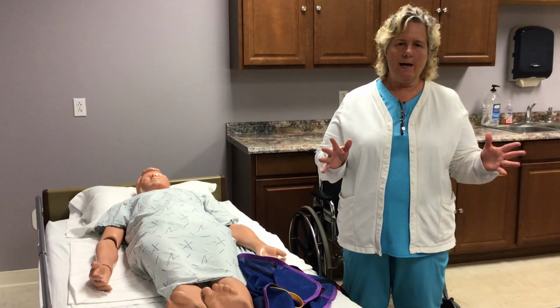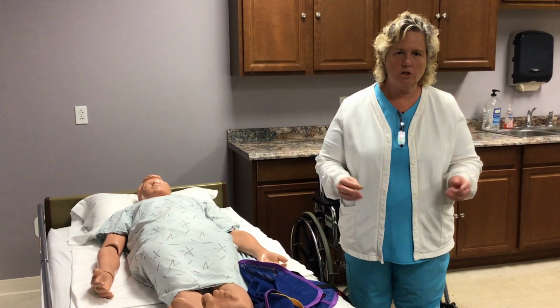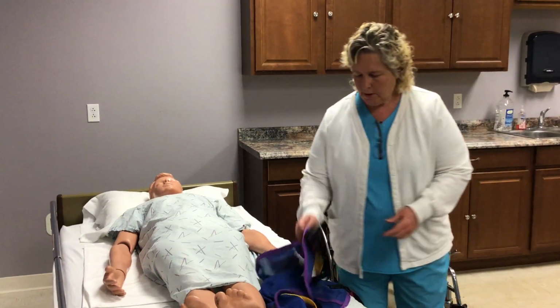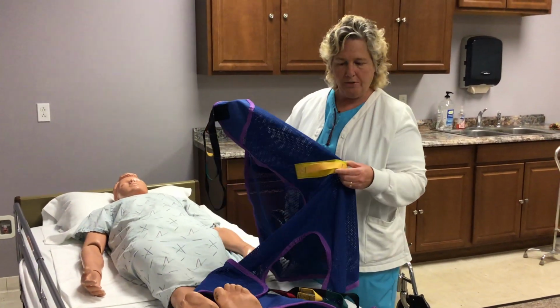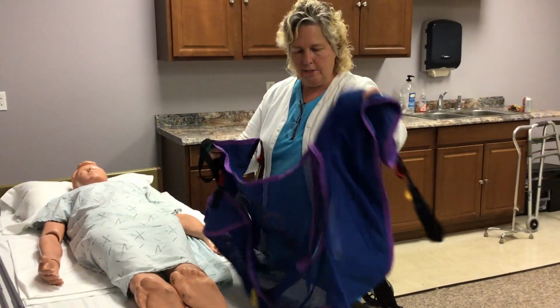There's all varieties of different types of sling lifts. Always read the manufacturer's instructions. Always get your training before you use one. This one just happens to be a net type. I'm going to hold it up so you can see it just a little bit. You would know this would be the outside because we would use these for handles later. So we would want them laying on this side.